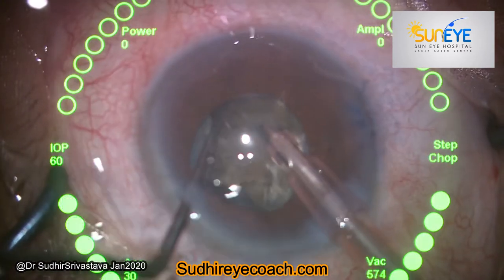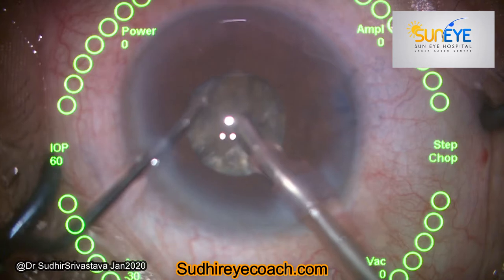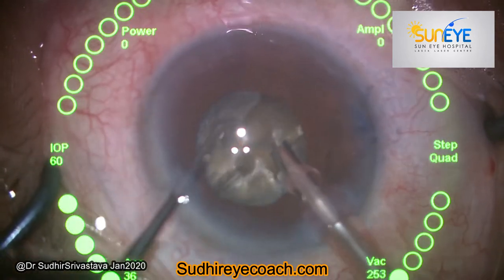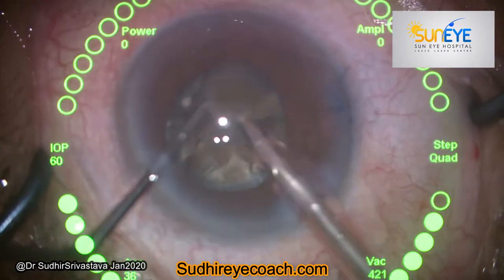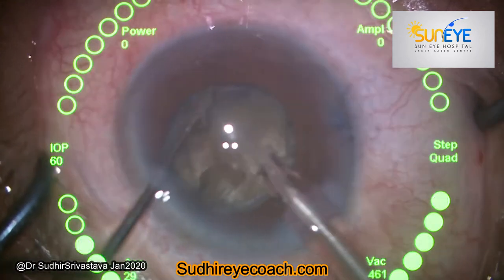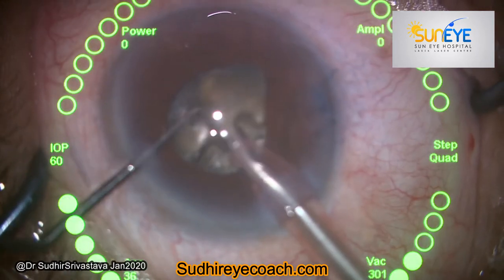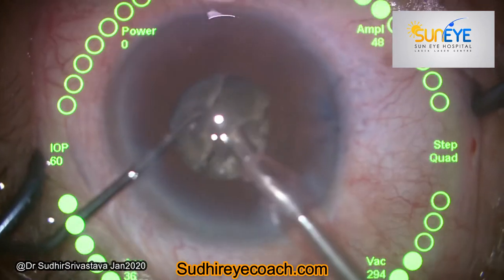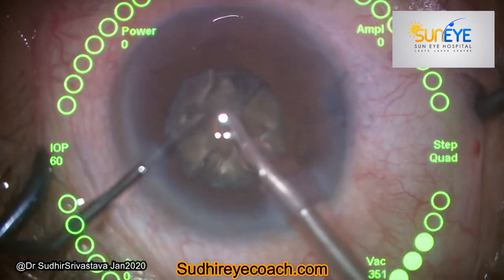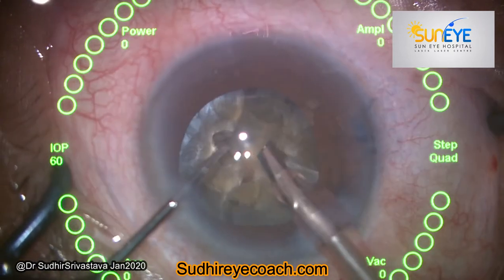Always try to avoid touching the iris. Once you catch the iris, it becomes more responsive and will start coming to the faco tip again and again. So whenever you are feeling unsafe, stop the surgery, withdraw the faco tip, and use intracameral mydriatic to dilate the pupil.